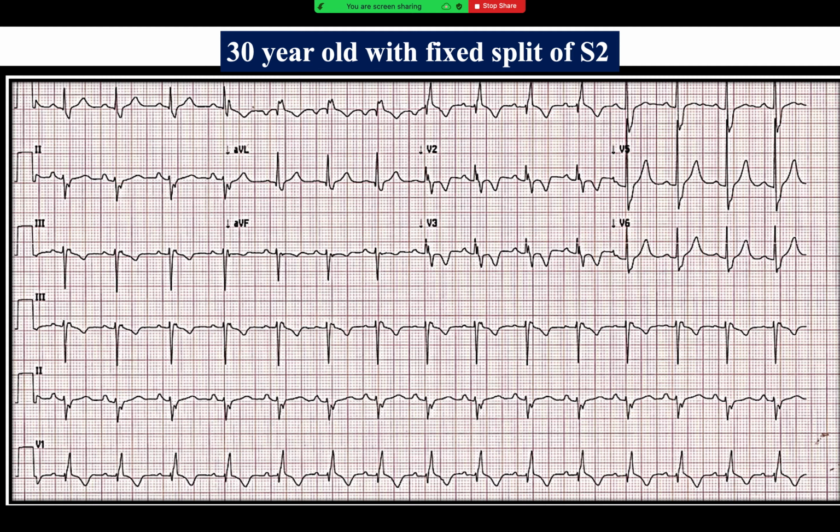Another patient, ECG in front of you. Come on, rapid fire. Quick, quick, quick. Sinus rhythm is there. Axis is left axis. What else do we notice? Right atrial enlargement is there. How about the PR intervals?